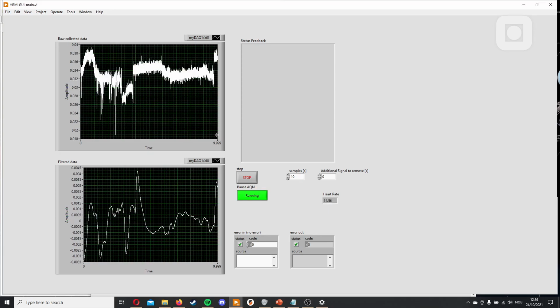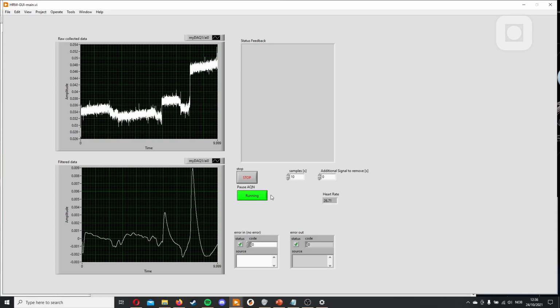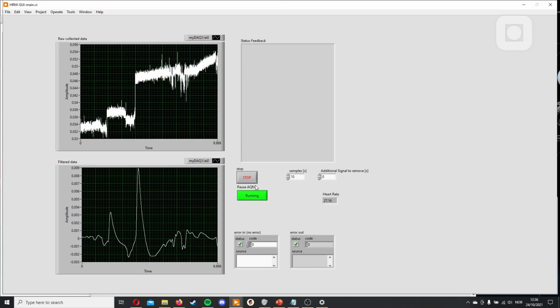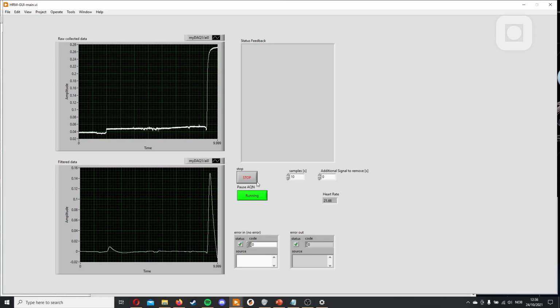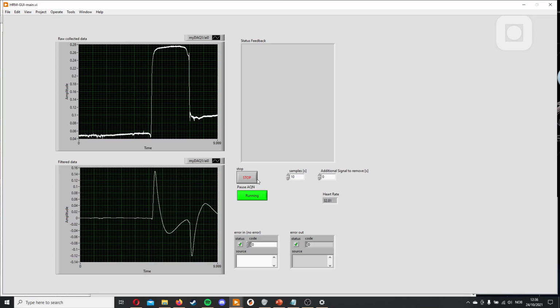So if I now want to keep it at that level, I can pause it, remove my finger, put it back again, and then unpause it. And you see it's at a very similar level, maybe not exactly the same level. But if I were to do that without pausing, we will see this jump.